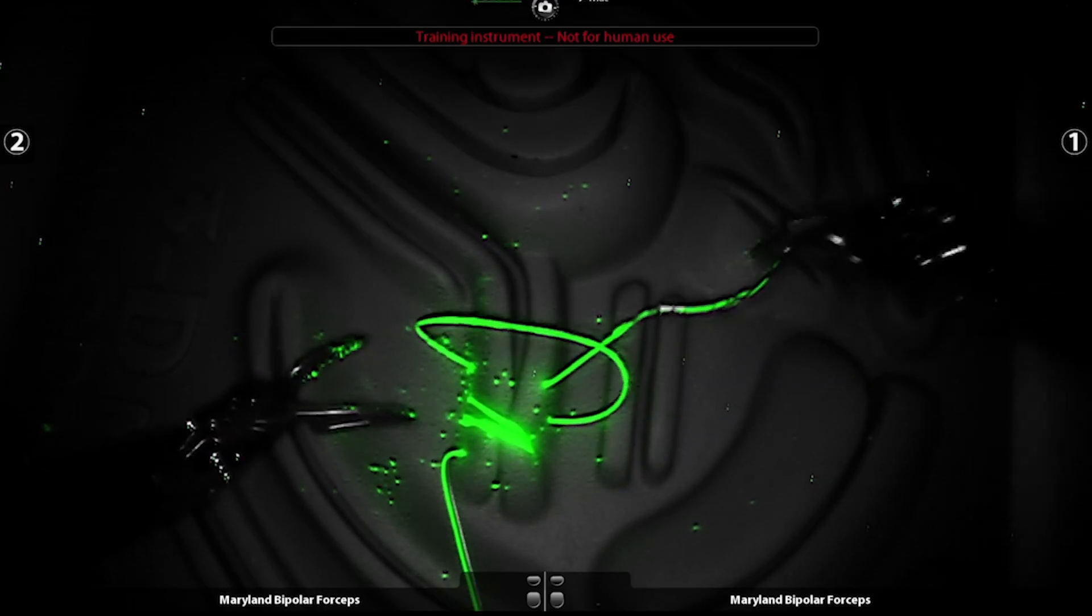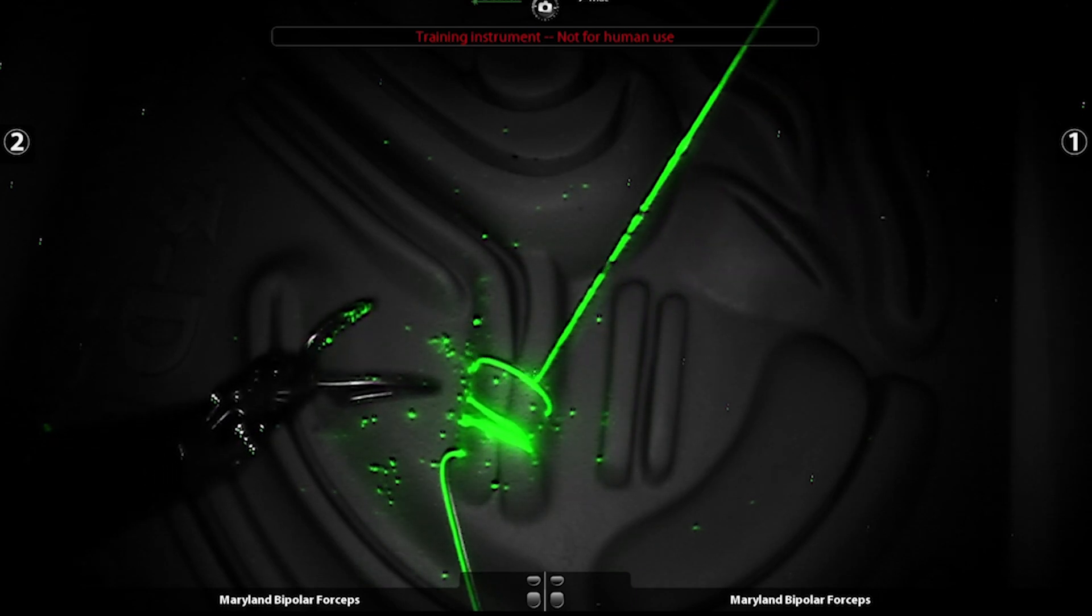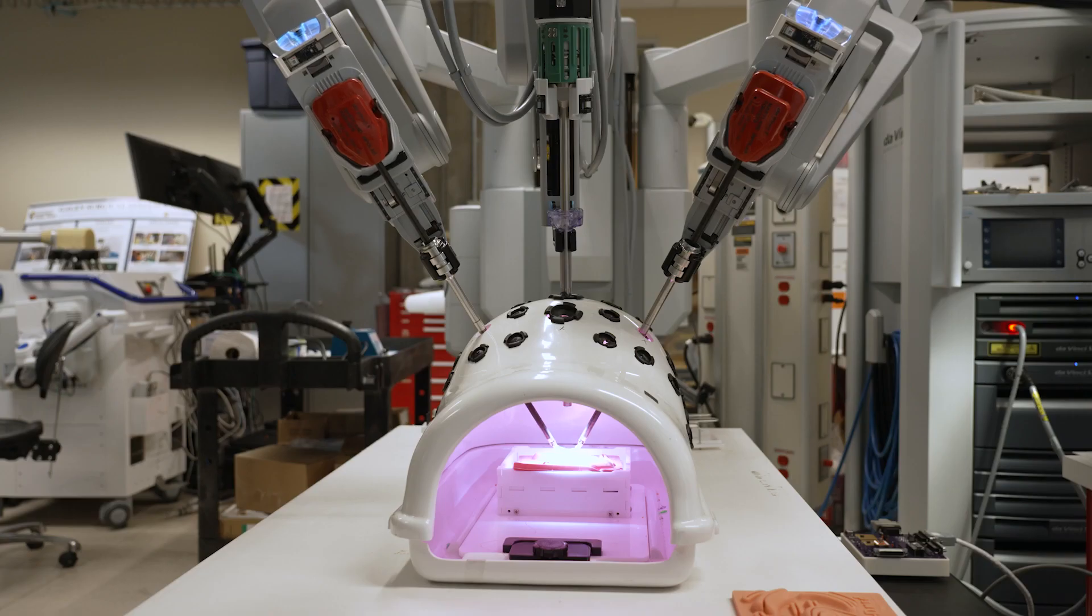That infrared camera displays the suture to the surgeon, and the infrared light allows that suture to be seen through blood and tissue.